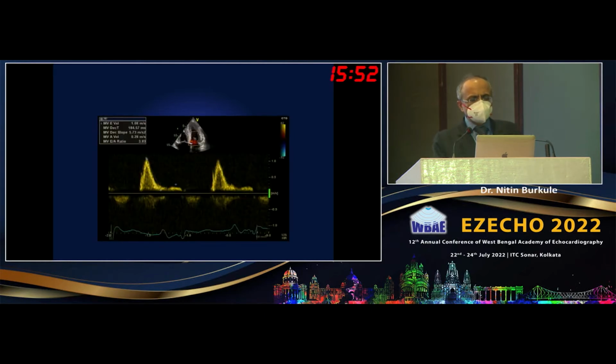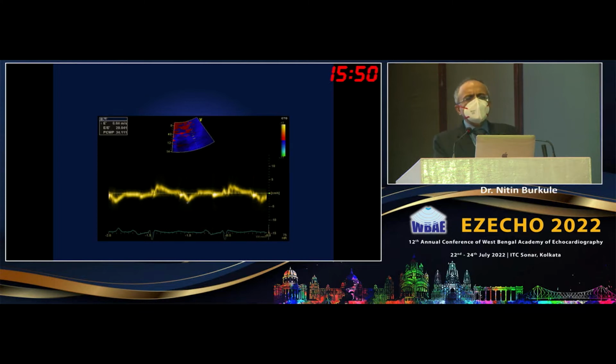The Doppler shows a restrictive filling pattern, and all the longitudinal velocities, S prime, E prime, A prime, are all less than 5 centimeters per second. So that is very classical, as you know.